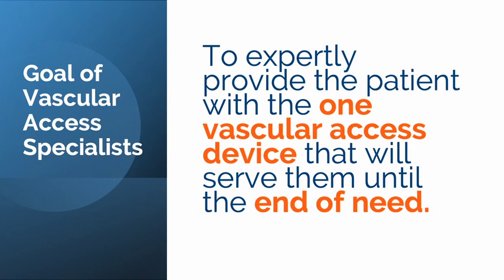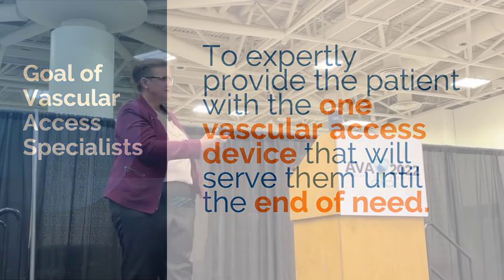All right, so what I believe is an overarching goal of vascular access, you can see if you believe this also, is that we want to expertly, that's us, provide the patient with one vascular access device that will serve them until the end of need. Can I get an amen? Okay, cool. All right, we're going to go through this again, so you will be tested.